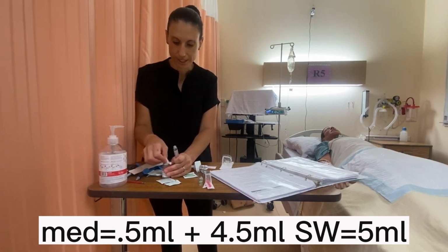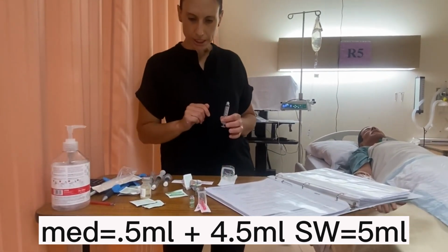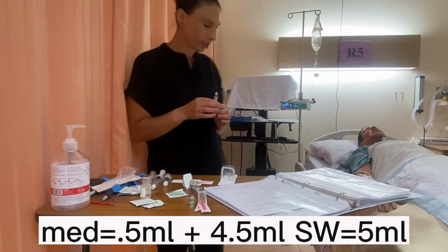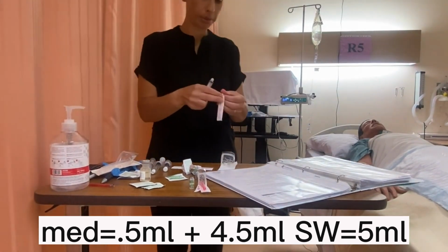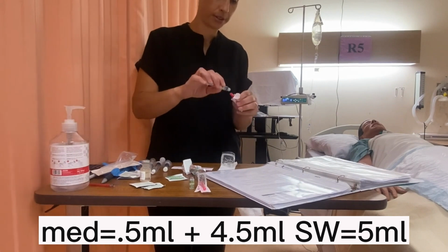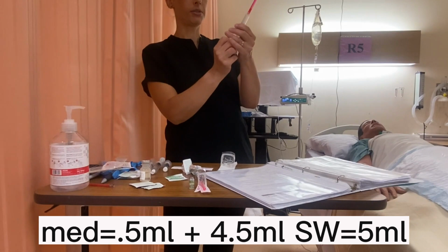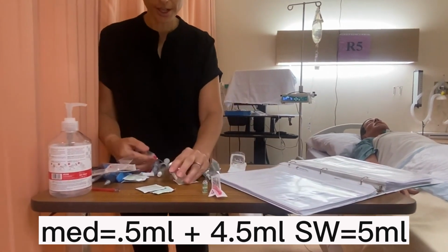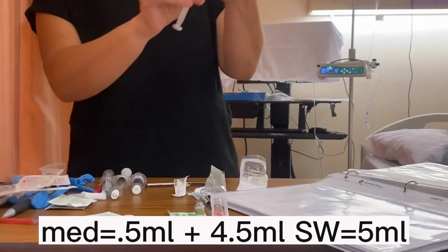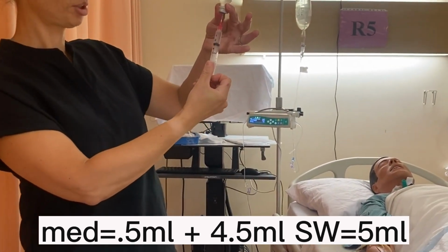So swabbing for 30 seconds, dry for 15. And then what I'm going to need is a blunt fill. So I'm just going to grab from my supply here a blunt fill, banana peel that back. Okay. And because it's a vial, we're going to inject air. Okay, so we've let that dry. So injected, and I'm going to pull back.